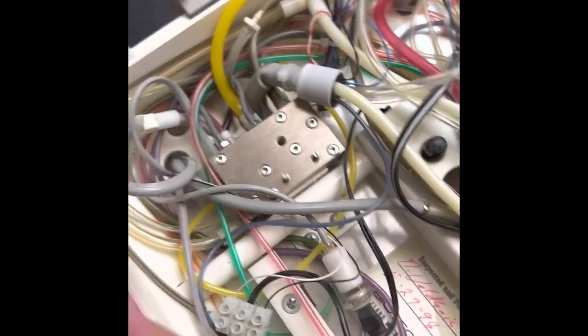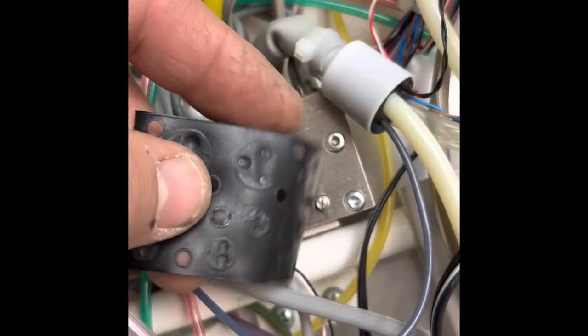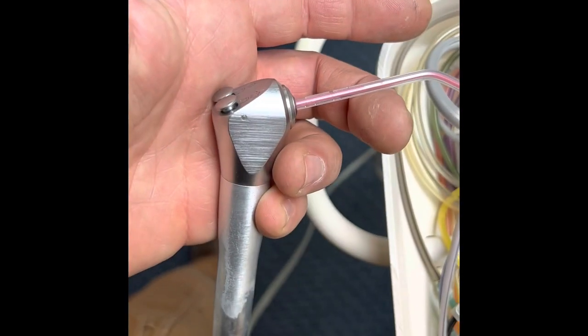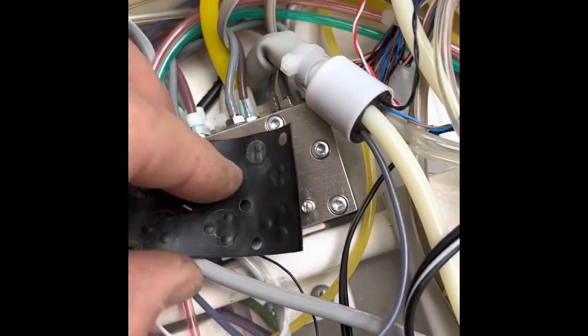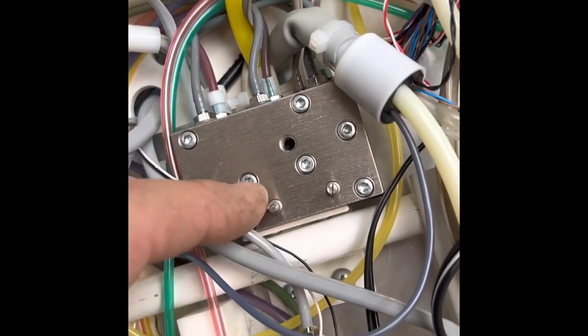Wow. Okay, it actually ended up being this diaphragm. The diaphragm was backfeeding air pressure through this line. And I only found it because at the end I could hear it making that noise. But this diaphragm was actually the reason that this air water syringe had air coming out of it on the water side. Very, very interesting problem. But yeah, crazy problems. Always check the diaphragm.